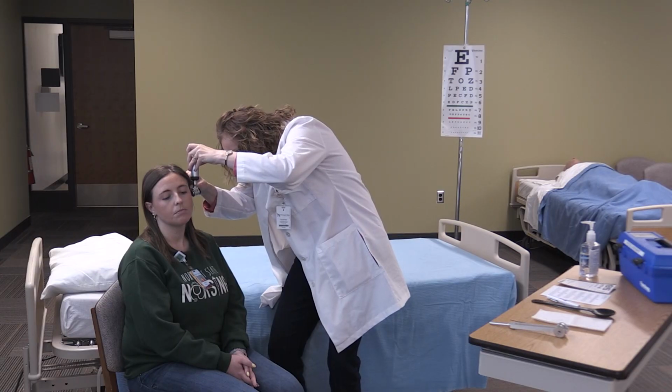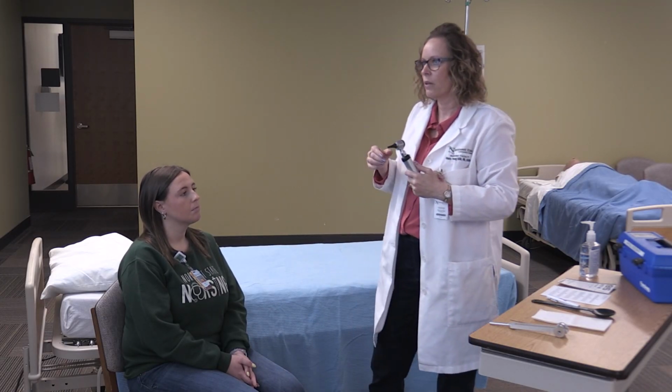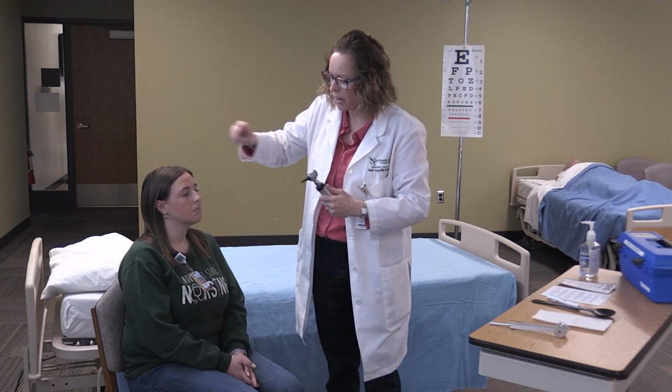I'm making sure that there are no foreign bodies. I note that there's some cerumen in there, and I can visualize the tympanic membrane, and it's translucent and pearly gray. I'm going to do that on both sides.